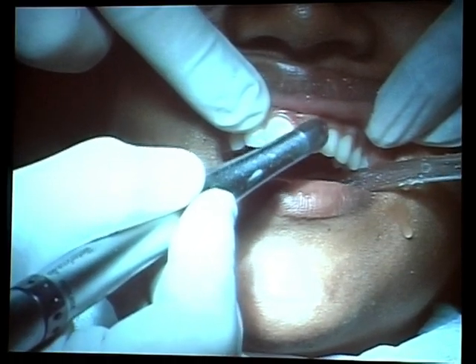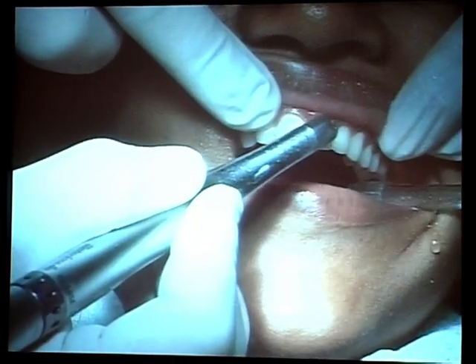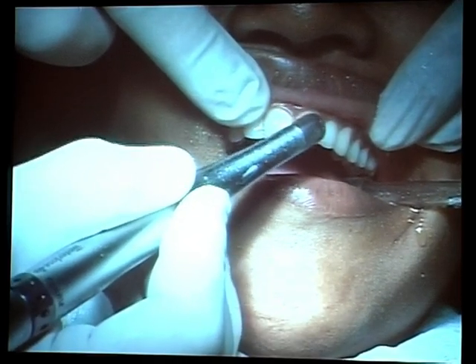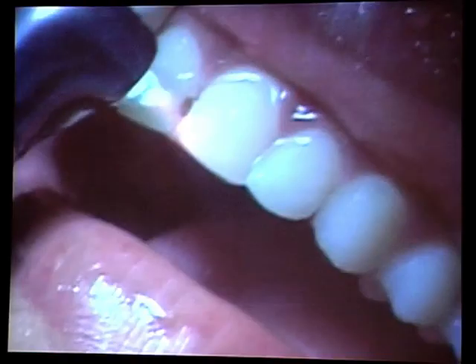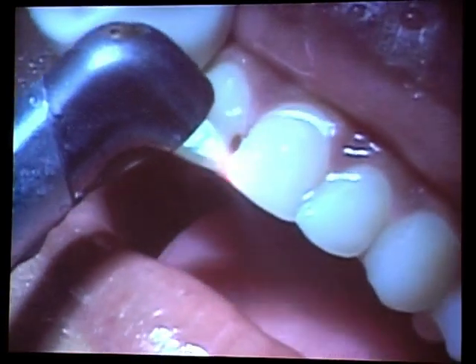And the patient doesn't feel the sensation even of the handpiece after having done this. So in our practice now, we use the erbium laser to do the preparation for a laminate, even if it's ceramic, and then finish it with a finishing diamond burr.